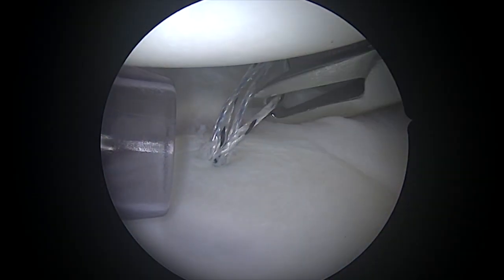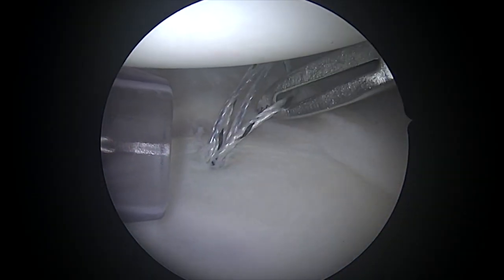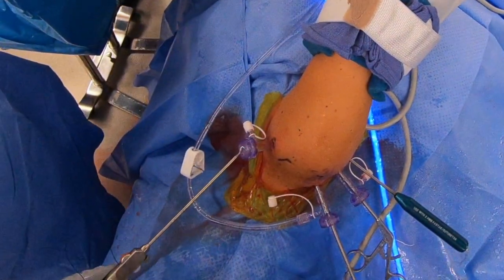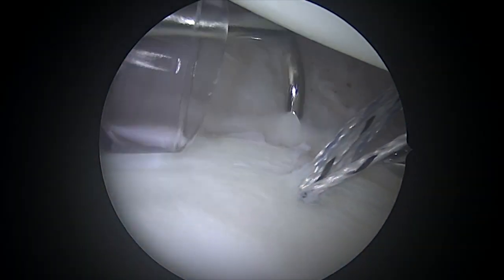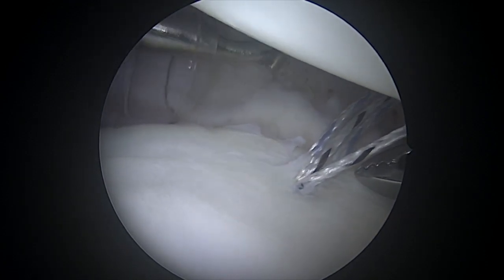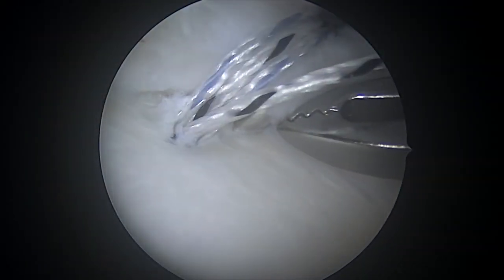We'll grasp one of our sutures here from the anteroinferior cannula, as can be seen here, and then I'll bring in our suture passer from posterior. This is a case where you really want to get a big bite of capsule, and I try to get this to exit as much as possible right where the anchor goes in.